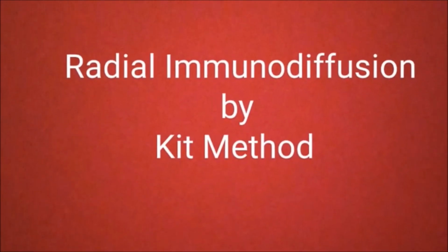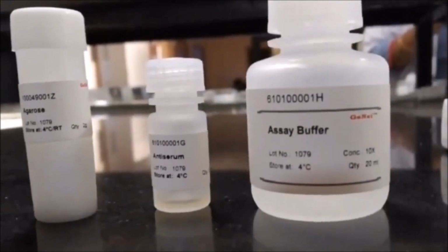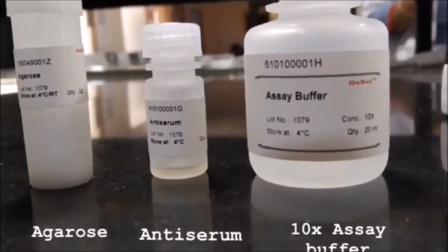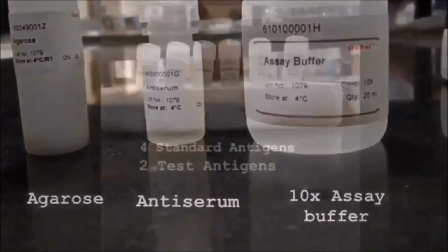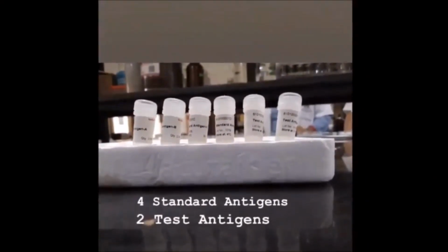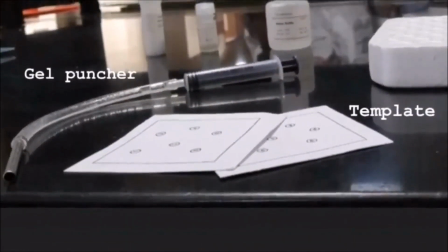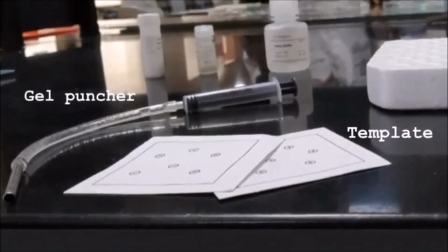The procedure of single radial immunodiffusion performed by a kit method is explained in detail ahead. Components of the kit include agarose, antiserum, and 10x assay buffer. There are 4 standard antigens and 2 test antigens. There is one gel puncture and a template to make the wells on the slide.